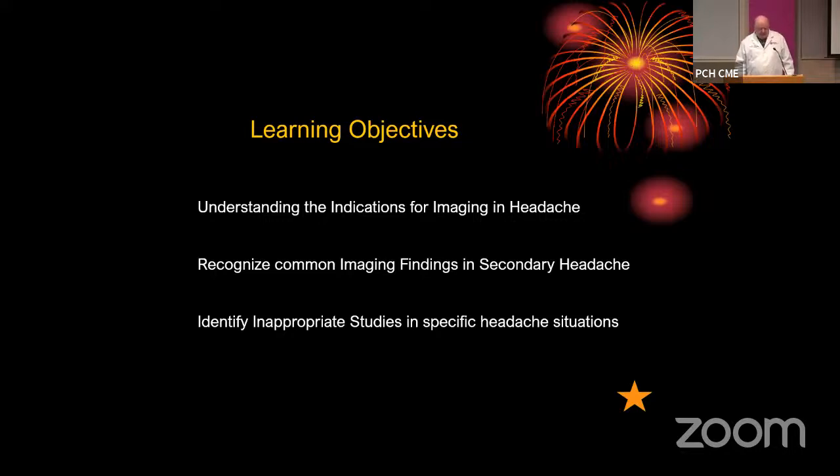Our learning objectives today will be understanding the indications for imaging in headache, recognizing common imaging findings in secondary headache, and identifying inappropriate studies in specific headache situations. And I'll just say, and both of us will repeat this, the idea is basically if you consider the patient to have a primary headache, there are really only very limited indications for imaging. But secondary headaches most likely will involve imaging.